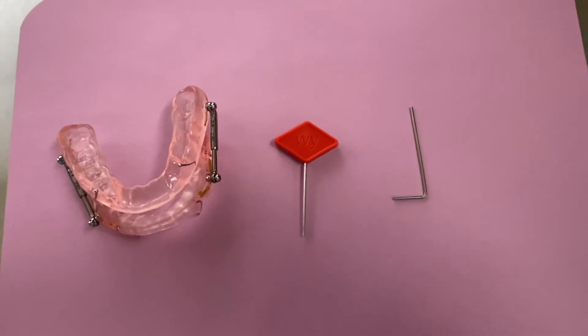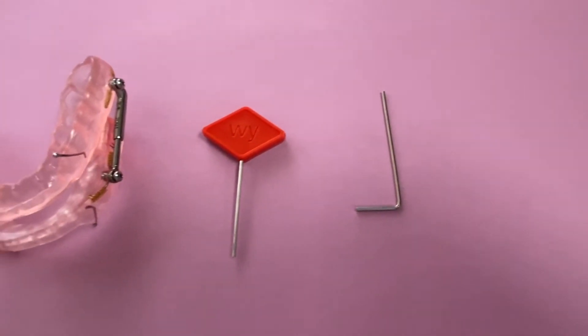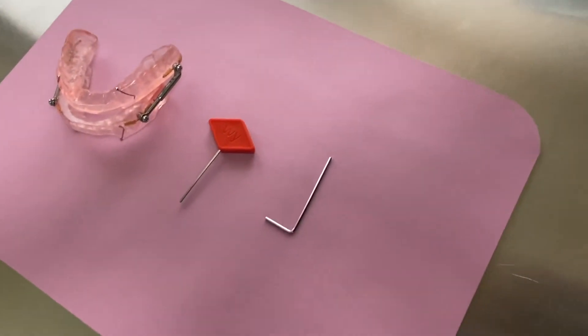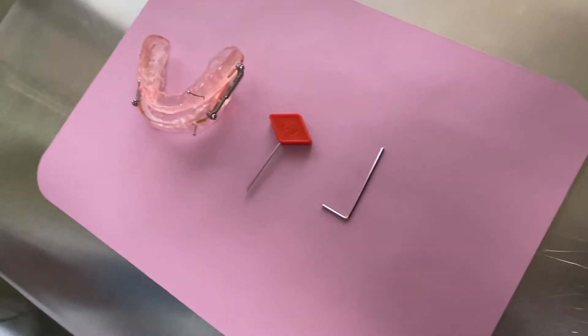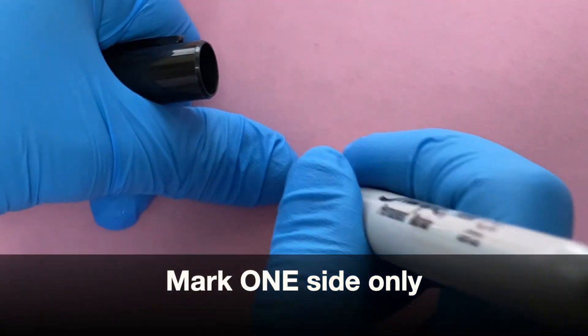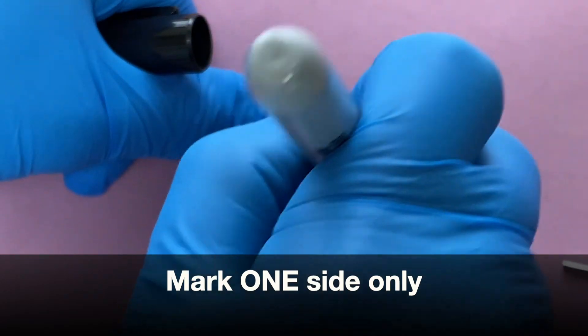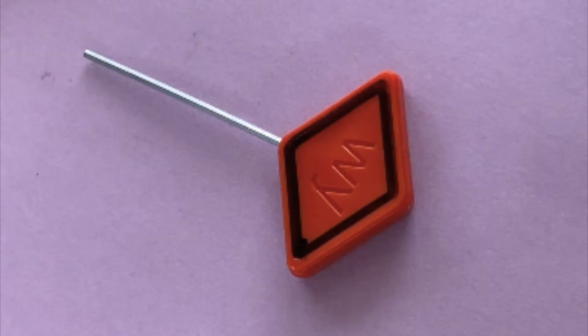So let's get started. I recommend you start by marking the orange-red tool that you receive. There'll be two tools — the main one is the orange-red one, and the other is the Allen wrench backup tool in case you lose the flat broader one. I take the flat broader one and mark an outline of one end with a black marker.